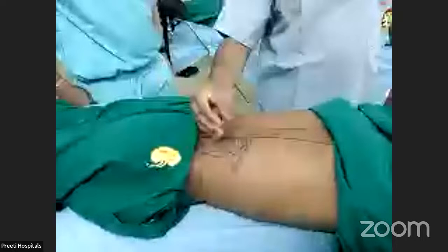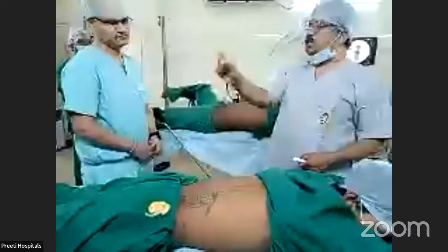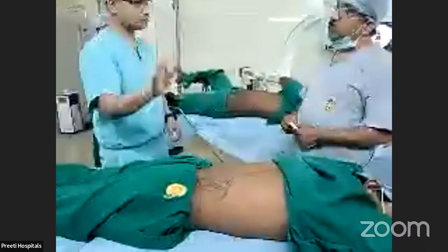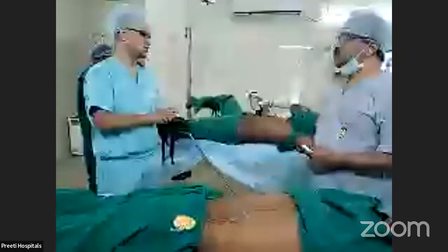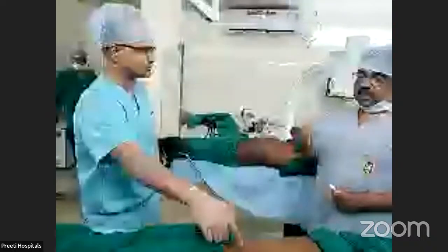Now coming to the middle calyx. In prone PCNL or supine PCNL, a middle calyx single stone, no bifid system, no trifid system, just a middle calyx large stone, which one do you prefer? Suppose the stone is in the posterior middle calyx. How will you identify? On a CT, we can know whether the stone is in the anterior calyx or the posterior middle calyx. Suppose the stone is in the posterior calyx.